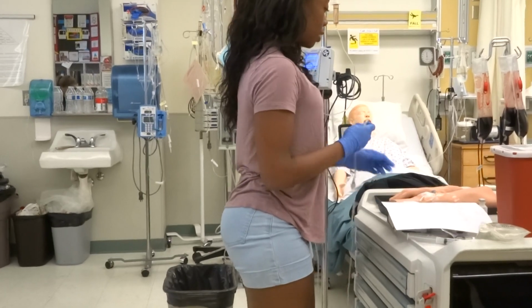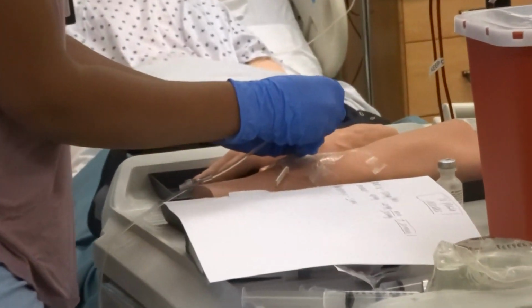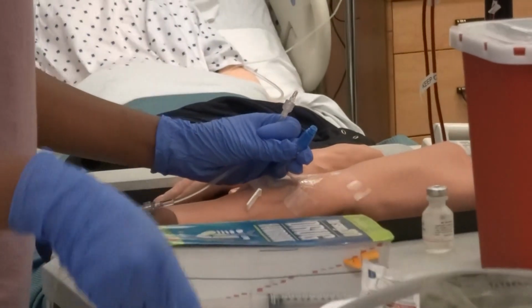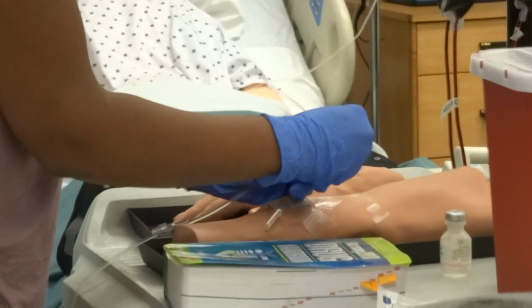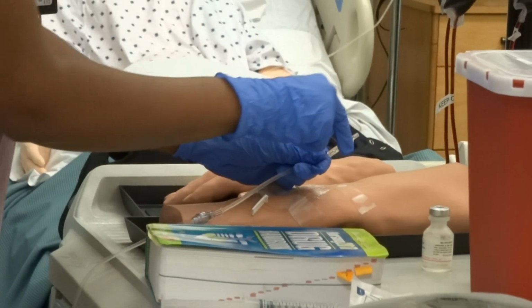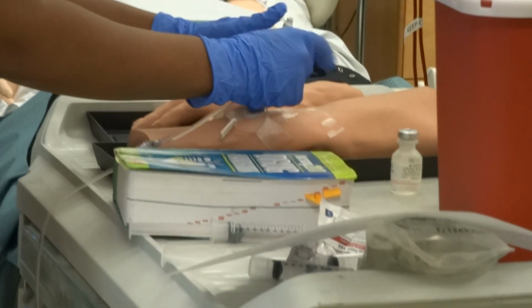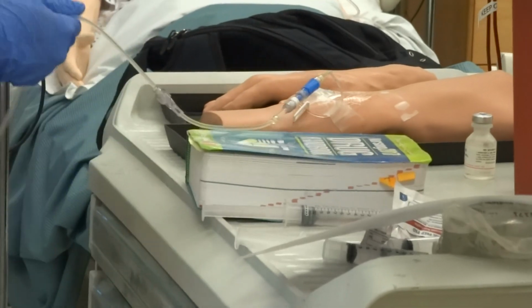So I come to this patient at this point, and of course I clean off the port for 20 seconds. Do that little piece. This is where this is supposed to go here. I clean for my 20 seconds. Then I go ahead and attach this. Mind you, that blue cap is still there, so go ahead and pop that off and throw it away now. Right? Here's my line back, make sure it's not touching the floor. And then I can say run.